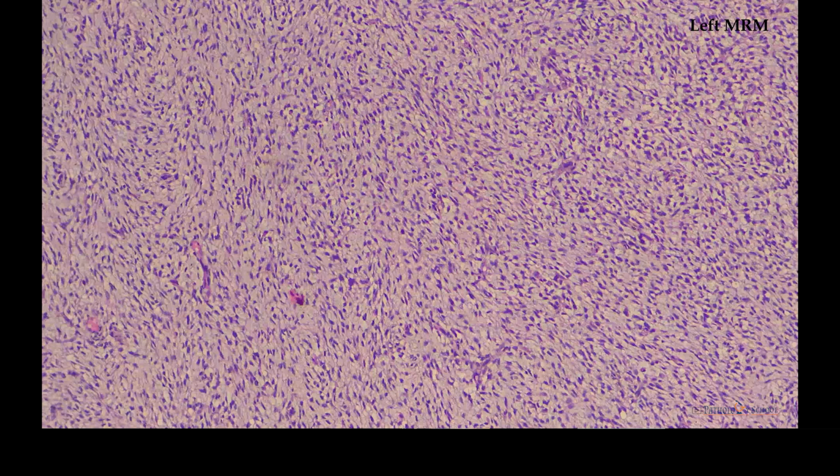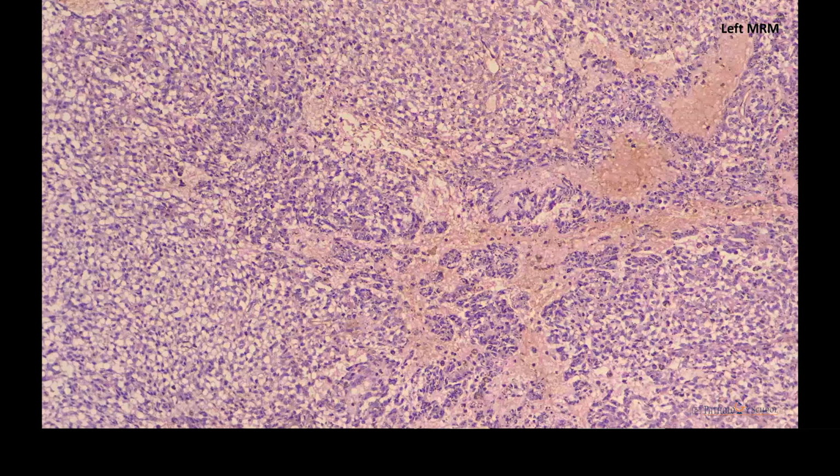There was definite stromal overgrowth, and in one of the sections, the edges of the tumor seemed to be infiltrative, and frequent mitotic activity was noted, which in some of the sections was at least 2 to 3 per high power field. Overall, it seemed that it could be more than 10 in 10 high power fields. There was no other differentiation or heterologous elements seen. These are again areas of increased cellularity and areas of hemorrhage. Next slide.